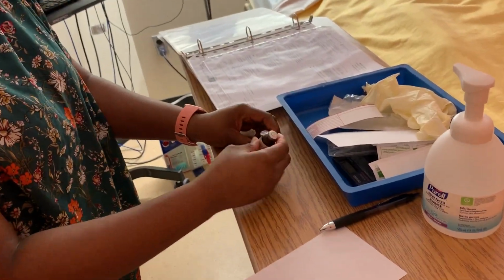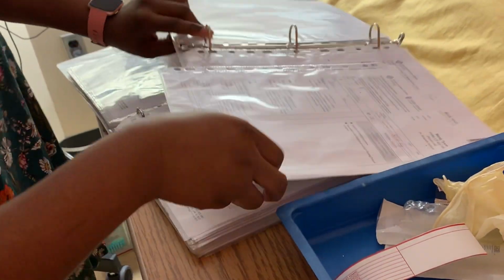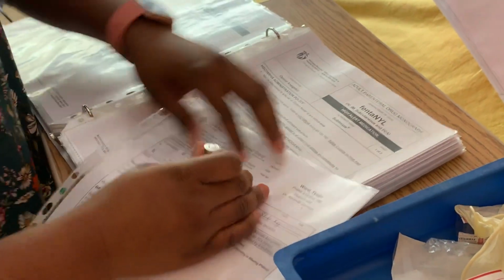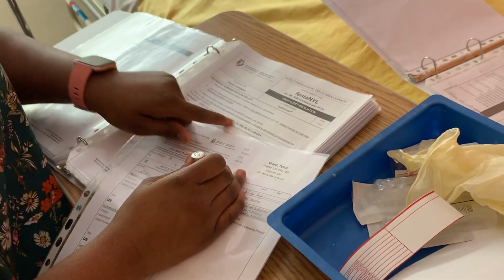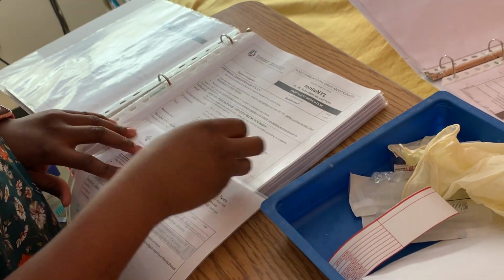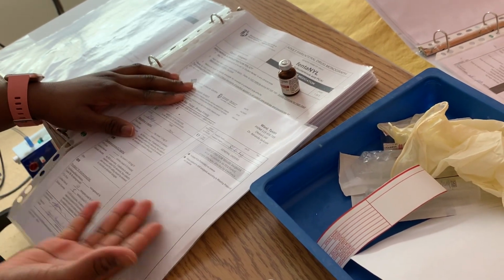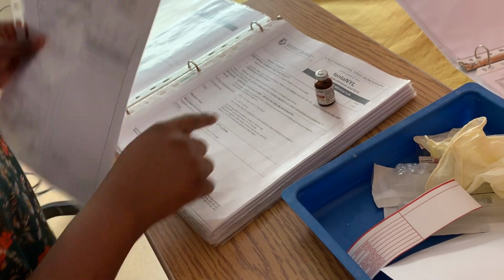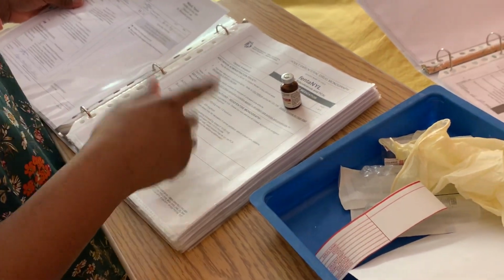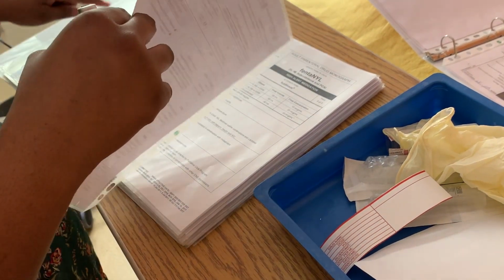So first of all, I'm going to make sure it's the right medication as well. So this is fentanyl. So going to my drug monograph. So this is fentanyl. So it's a high alert medication, and it can be administered as well by a student nurse. So moving on. So this is PCA. The normal dose is within like 10 to 15 micrograms, so it's within the range. Because what I'm giving is 10 micrograms, and the normal dose is 10 to 15 micrograms. So this is good. So I'm going to go ahead to prepare my medication.